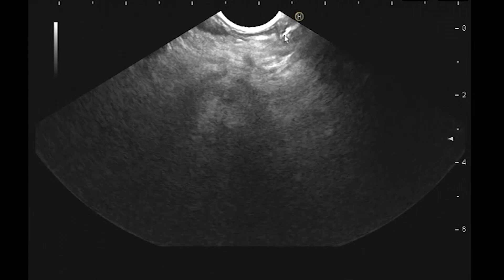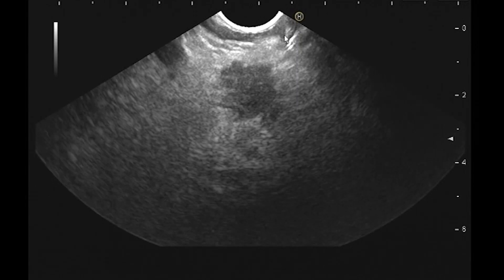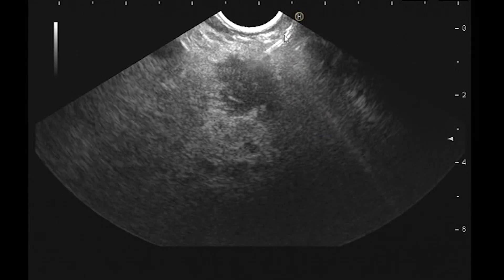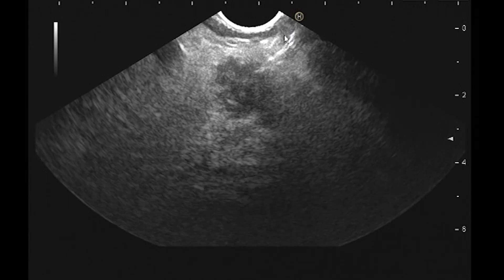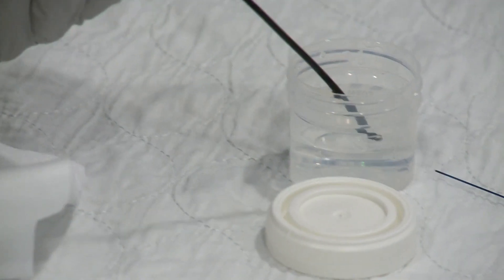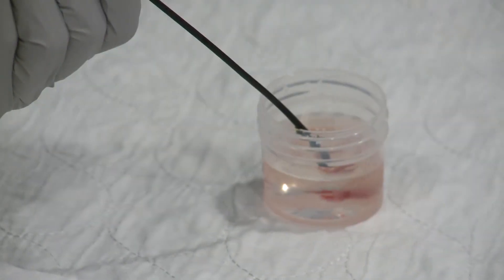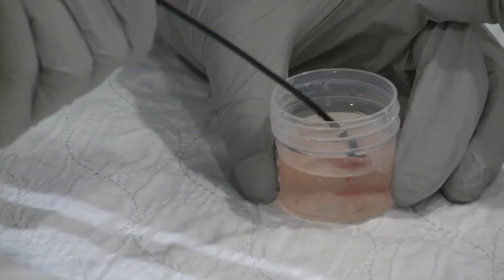There's the needle right here. I'm going to put the needle in through the wall. Through the wall — I'm in there. In we go. It goes in very nicely, nice and smooth action. I'm trying to go in multiple different places — coming out, going somewhere else, coming back, going somewhere else. This should be enough for the first pass. We're getting a lot of blood, but presumably there's tissue in there somewhere. I do see some white core tissue there. We'll do another one just in case.